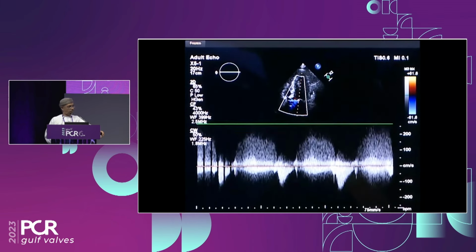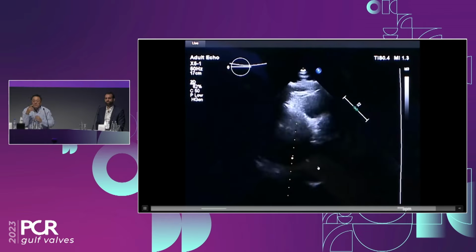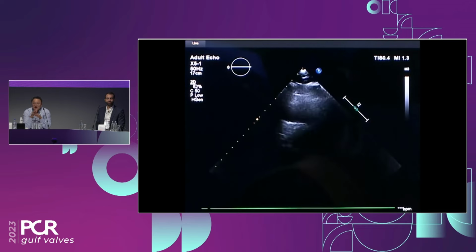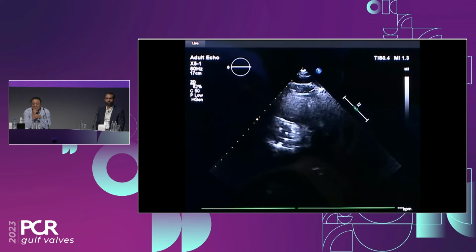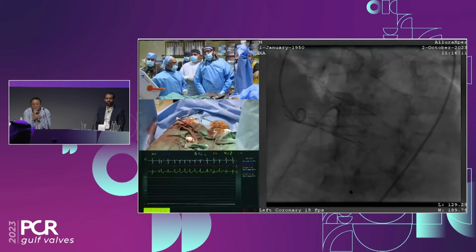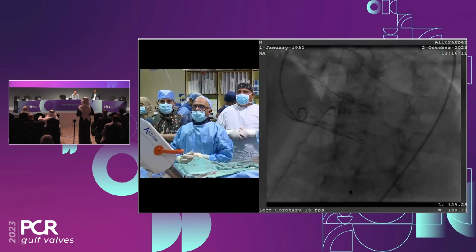Dr. Balghaith, what about the outside cuff, is it a good technique for sealing with this valve? And this is okay. I think they were very aggressive in this case with the balloon. We don't use this balloon too much.